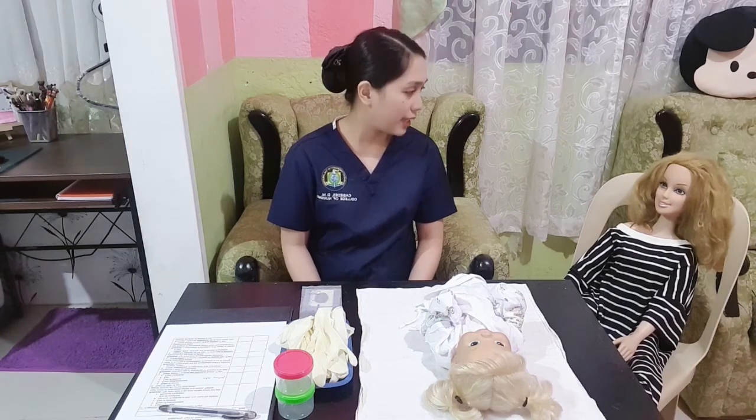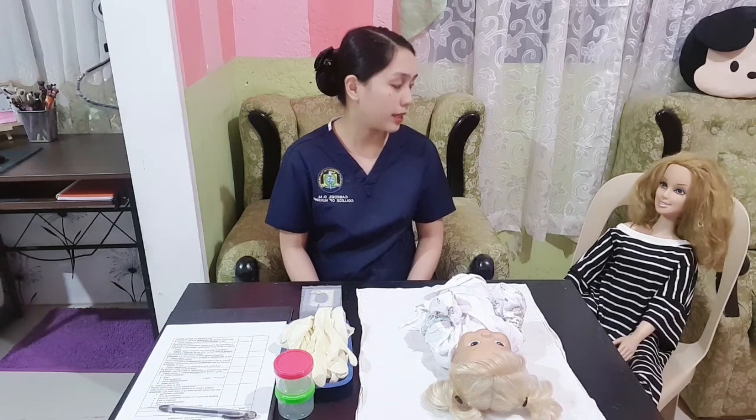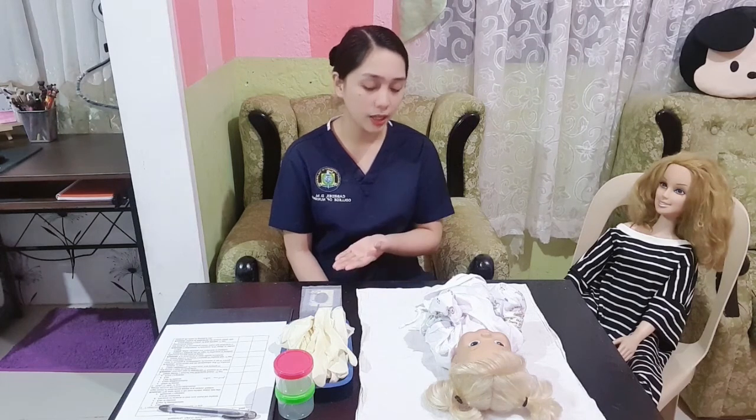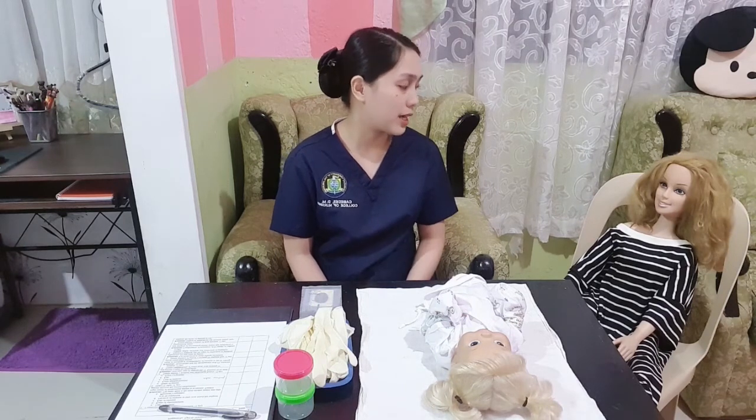Then, explain the procedure to the mother or the significant other of my patient. This helps minimize the anxiety. Good day, ma'am. I'm Dennis Kate Cabiedes and I will be your student nurse for today. I will be doing a wee bag attachment to your baby, on which I will be using a special bag that is made to fit over your baby's genital area. This will collect urine samples from your baby.